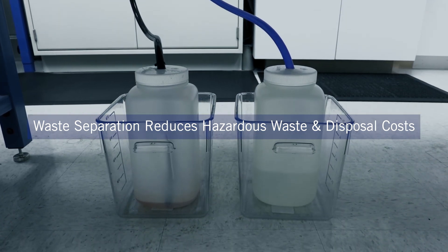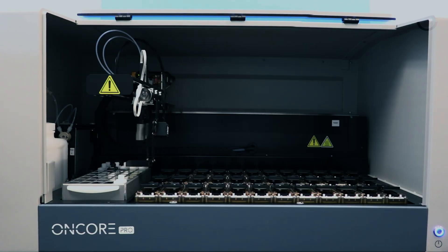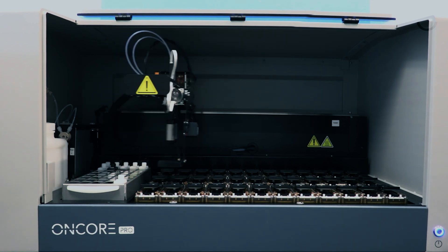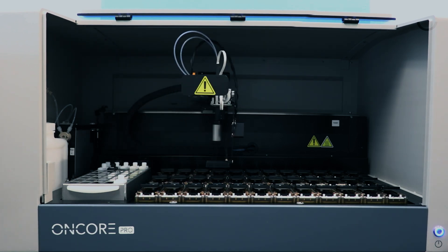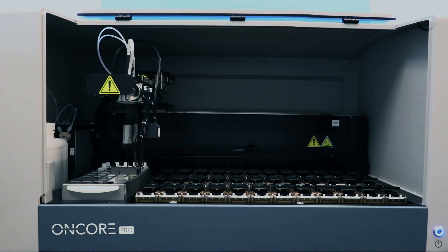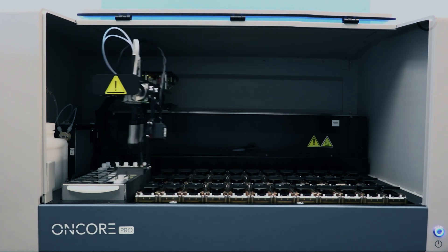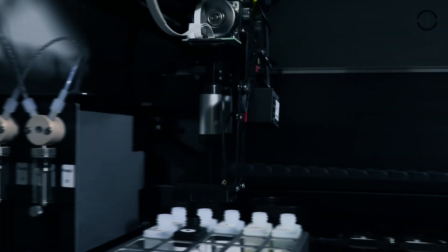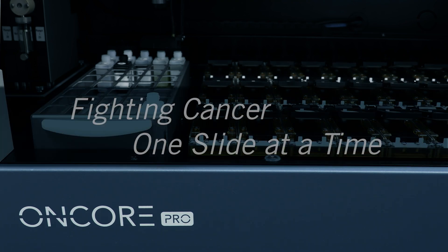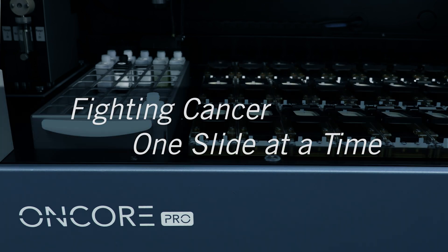The ONCORE Pro's compact size and small reagent footprint make it an ideal fit for any lab. Let BioCare Medical be your total solution, or let us enhance your current solutions. We'd love to work together with you in fighting cancer, one slide at a time.